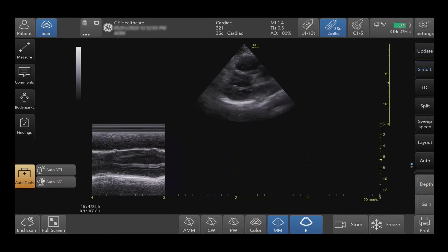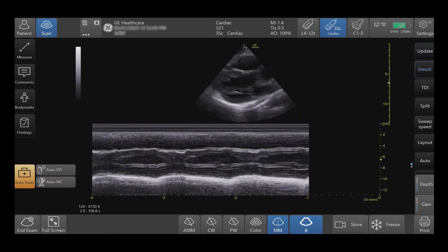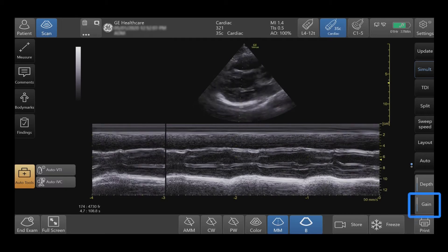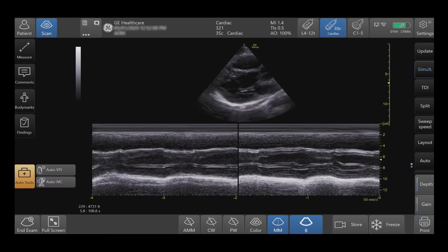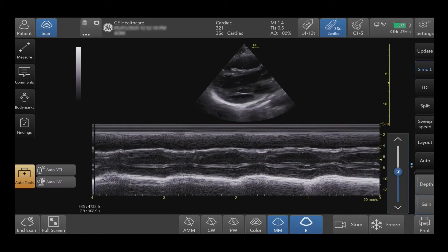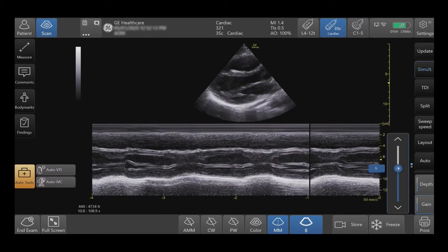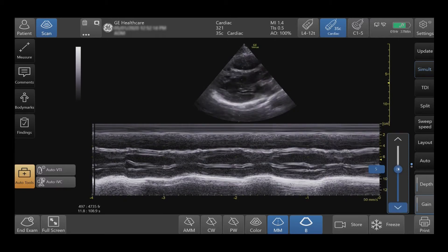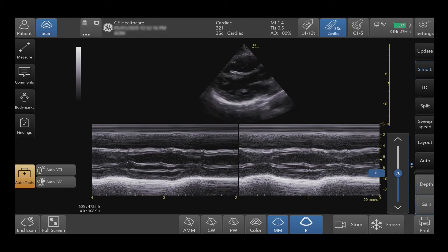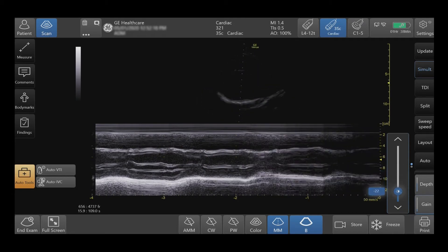Adjustments can be made on Anatomical M Mode and M Mode. Use the Gain button to increase or decrease the M Mode brightness by pressing the arrows up or down or by using the sliding sidebar.